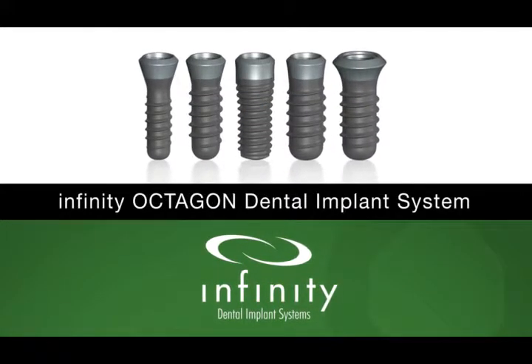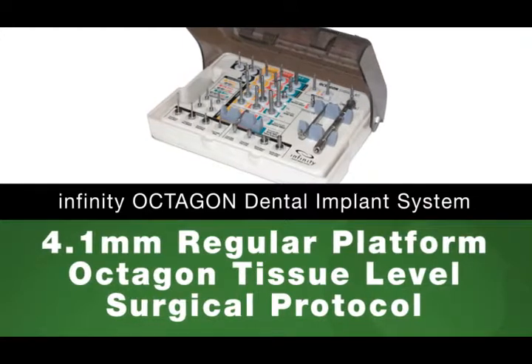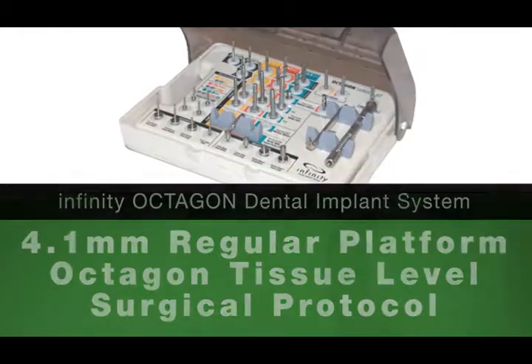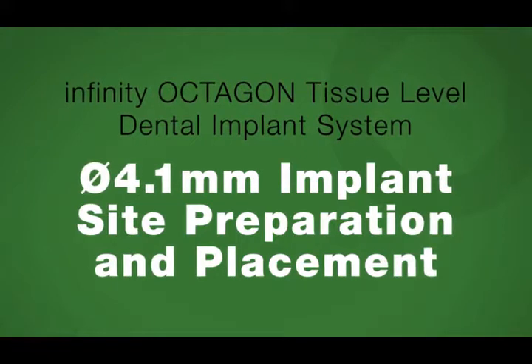This video will walk you through surgical preparation, placement, and healing protocols for 4.1 mm regular platform Infinity OCTAGON tissue-level dental implants. We will begin with the implant site preparation and placement protocol.